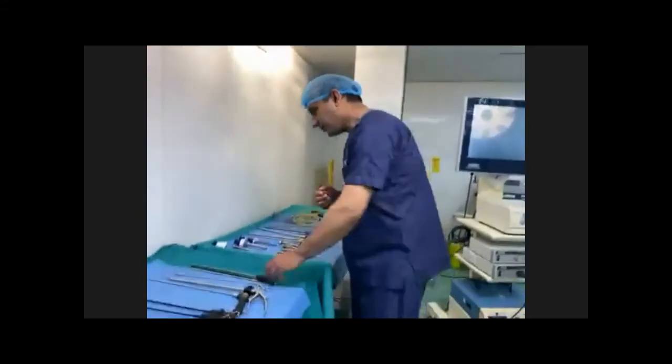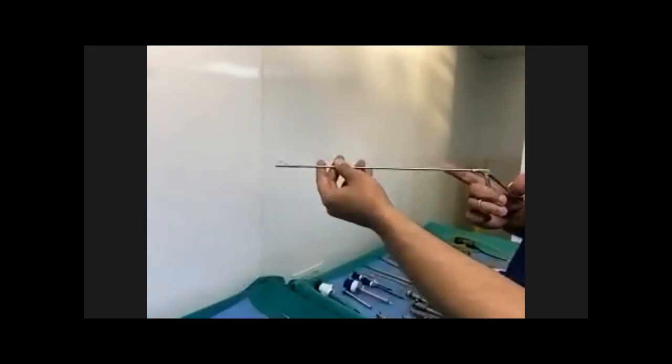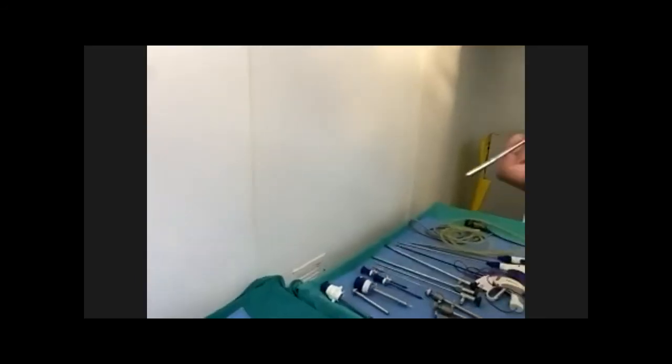it will autocorrect and will be in a straight line. Okay, now this is a grasper, punch biopsy forceps. Laparoscopically, if you want to have a biopsy, you can just hold it and pull it, right?